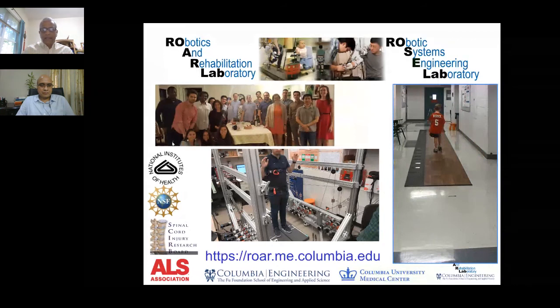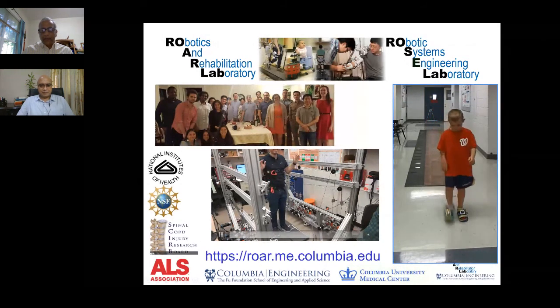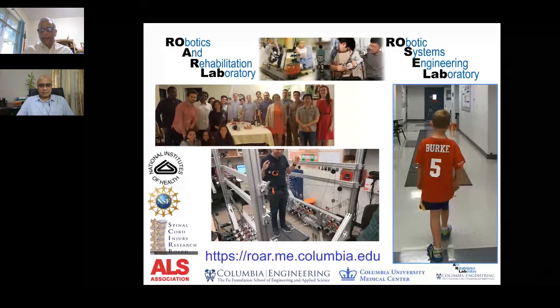These are some other studies where we're looking at instrumented shoes for children with cerebral palsy, or there's another device that you can see on the left out here. This is motivated by patients with spinal cord injury who are not able to stand because of the poor sensory motor control of these individuals. So we have a lot more applications at this time, looking at spinal cord injury, walking, gait, and function of some of these.